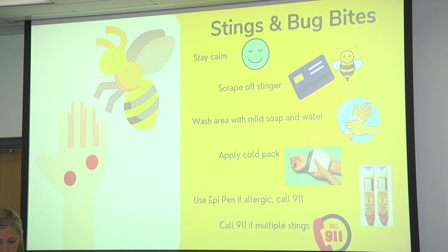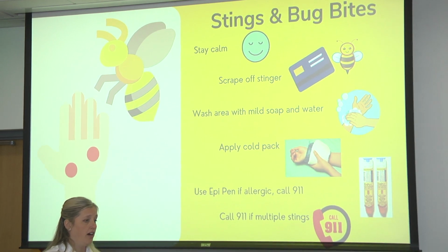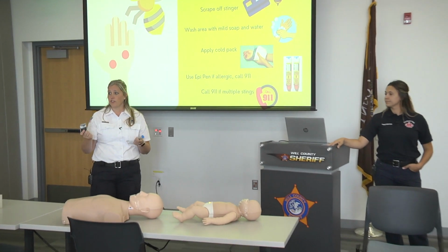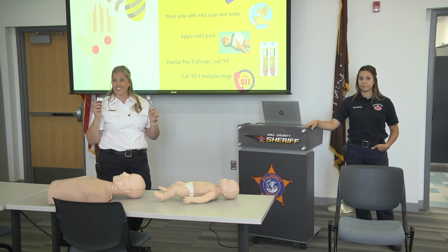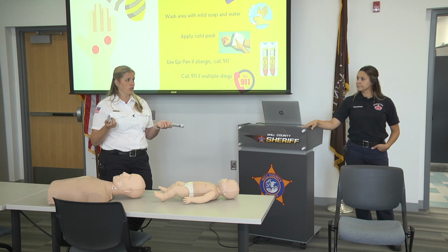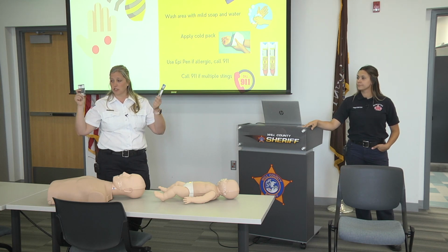If they are allergic, because we all know people who are allergic to bees, to wasps, to hornets, those kind of things that have stingers. So that's when they may have something like an EpiPen. For any kind of an allergy, if you or any of your family or friends are allergic enough to need an EpiPen, it's always good to try to play with a trainer, which is what we have here.